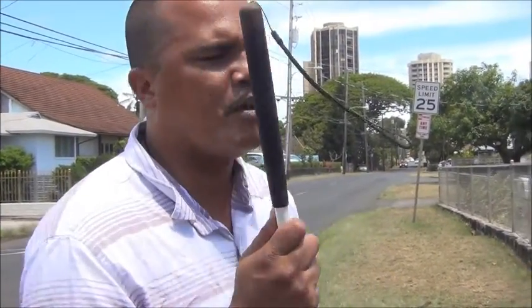Another thing I do use is the flow of traffic. I'll make sure that the traffic stays at a certain distance away from me, where I feel safe and I don't get too close or too far away from it. I also pay attention to where the cars are traveling, so it gives me an idea of where I need to be heading, or if I'm walking in a straight line. So this is what I mean when I say shorelining.